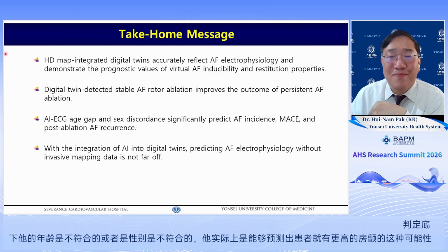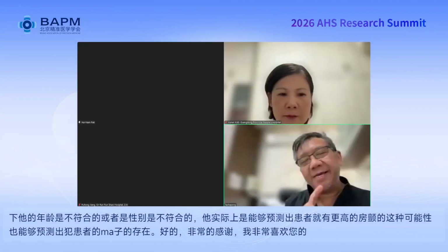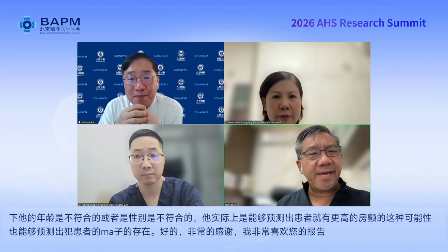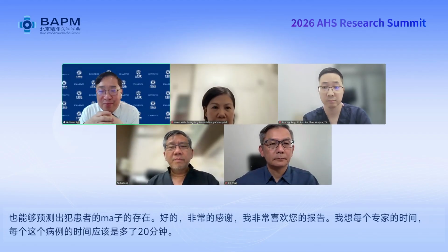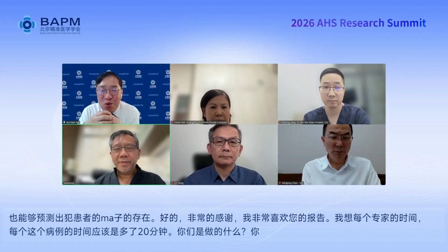Professor Park, with the QVIA, I see the turnaround time is about 20 minutes or so, right? Yeah, when you have to send the data out to the core lab. What do you do in the meantime? So you do the PVI? Yes, during that time we do PVI. So 20 minutes and then you come back and ablate the rest?